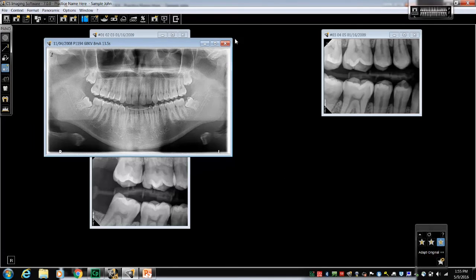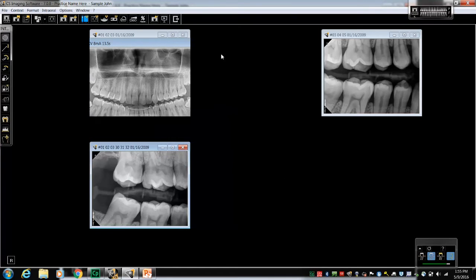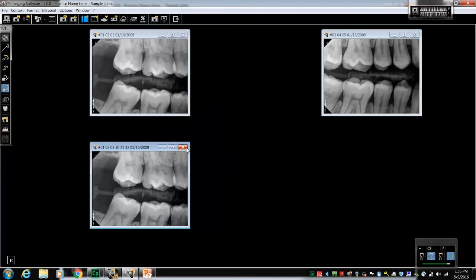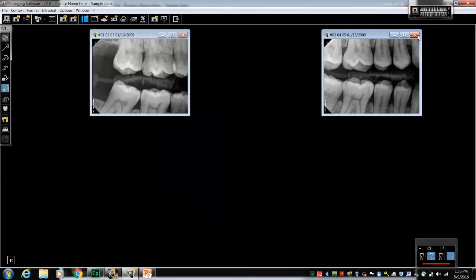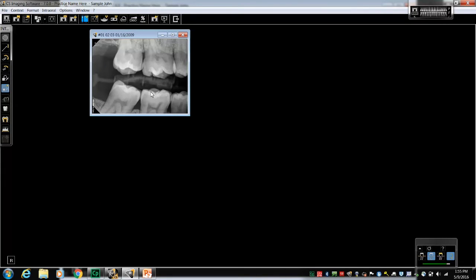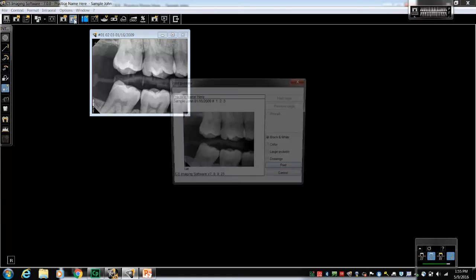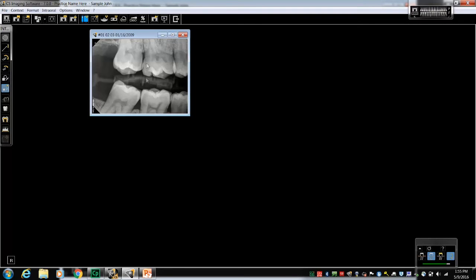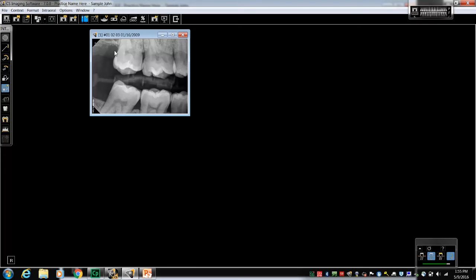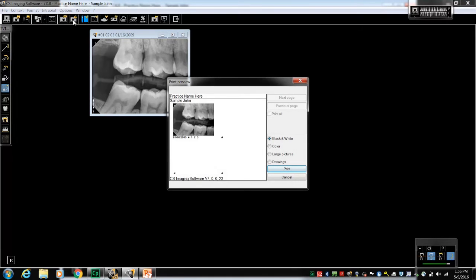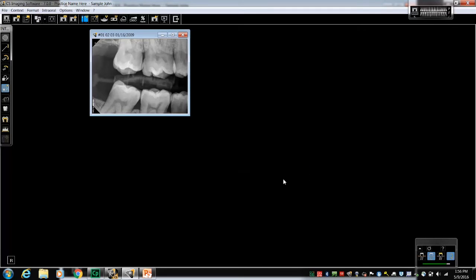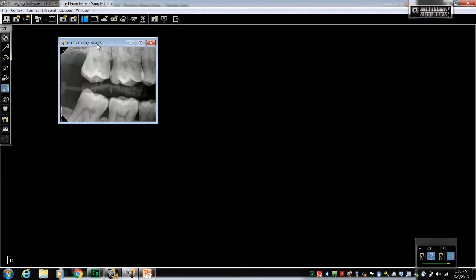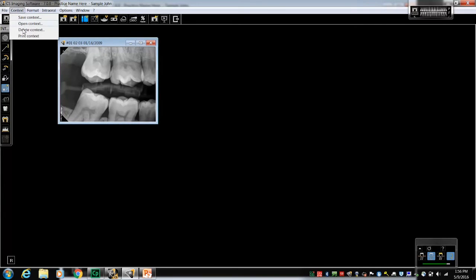If you just have one image open, even though it's a bite wing, it's a single image, and you press the print icon, that one image fills the whole page. Options for making that smaller include the same technique for printing up to four images on a page. Holding down the control key on the keyboard, and with the mouse selecting one left mouse click. It puts a number in a bracket. Select the printer icon and it's basically a fourth of the page. So you could do this up to four times to have four images on one page. Another convenient way for printing a single image would be selecting context and print context. This will actually print the image in the size that it's displayed in the workspace.